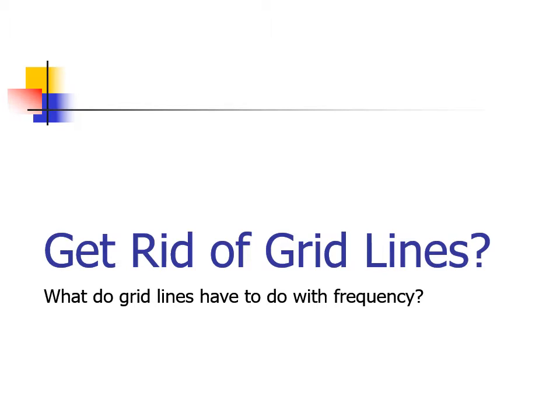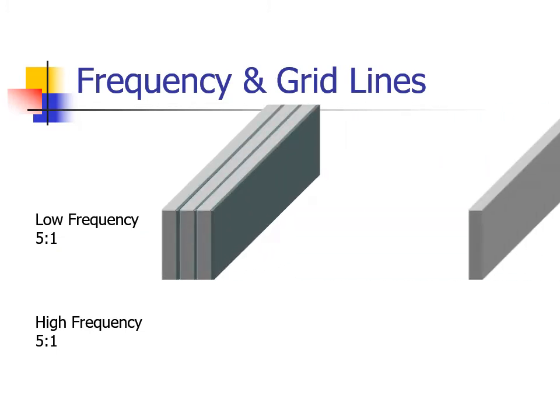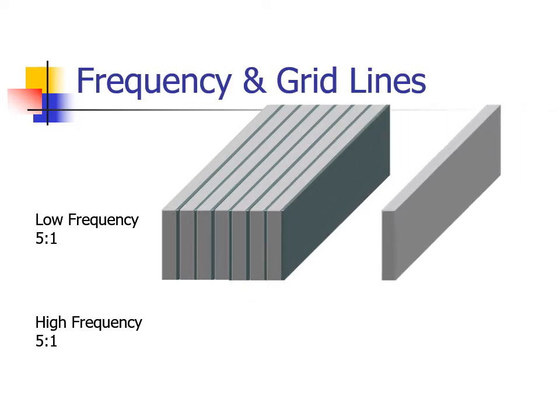If you can't say that you've ever seen grid lines on an image, they were hidden or obscured by the manufacturer of your equipment by one of two methods. The first method for hiding grid lines is to make them small. Small things are harder to see.